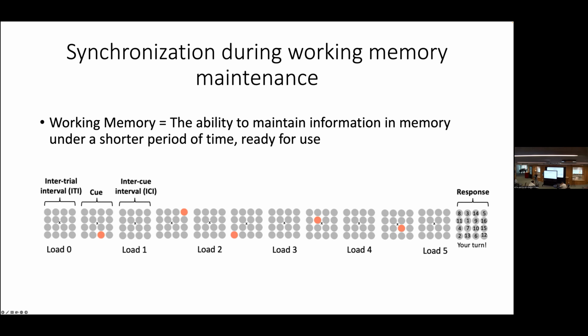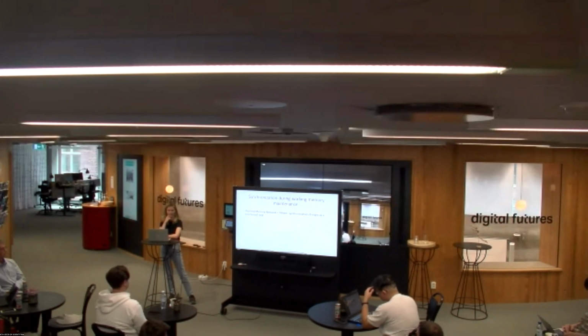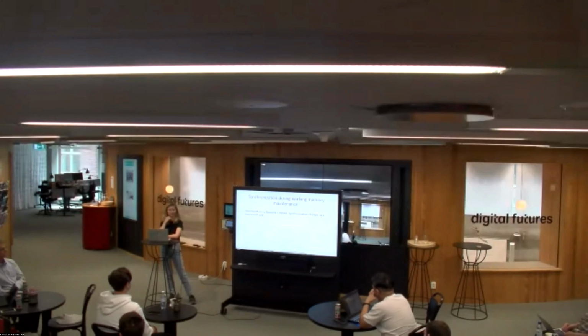And as I said, from this, we wanted to define sort of a working memory network. And for an edge in the brain to be part of this working memory network, we said that there had to be a significant change in synchronization as a function of load. Those are the criteria to be part of it. A problem when looking at these more complex cognitive functions is that the pattern of activity can vary a lot from person to person.